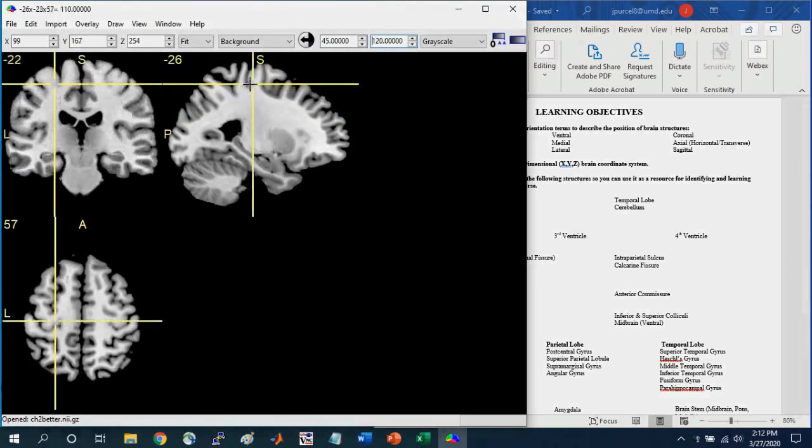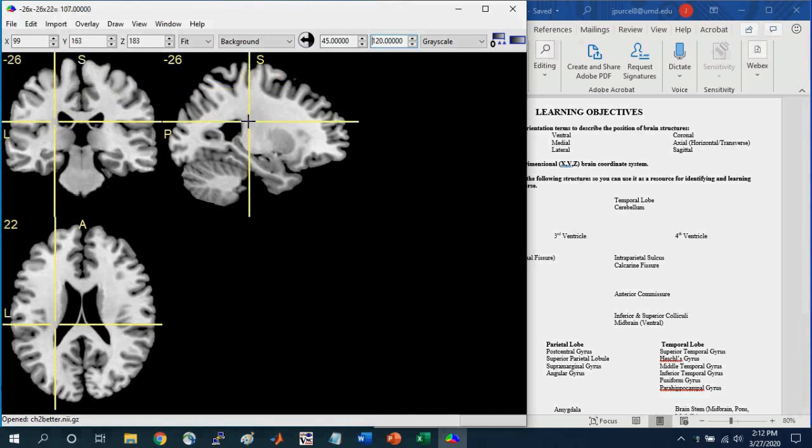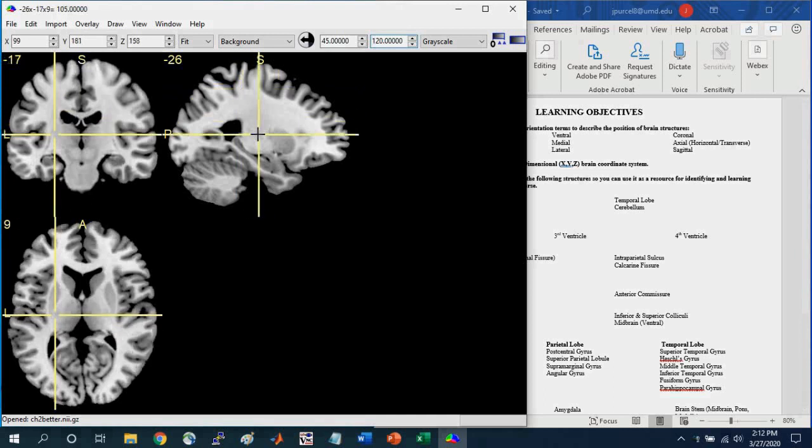So we've gone over some of the parameters that are useful in MRI-Cron for brain navigation.